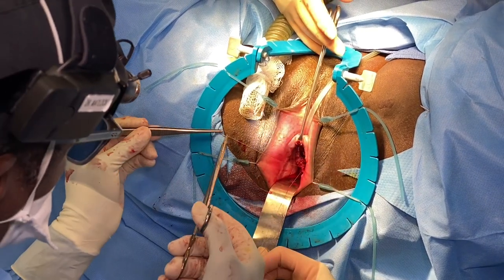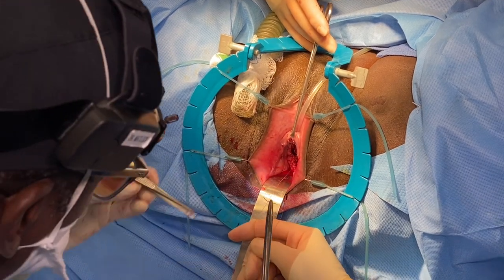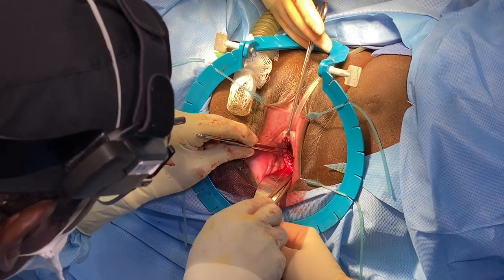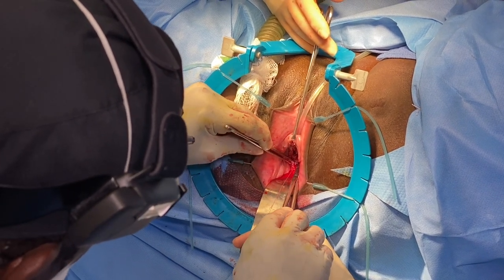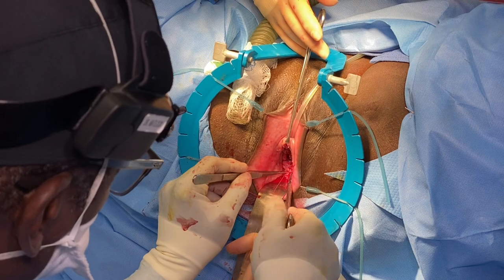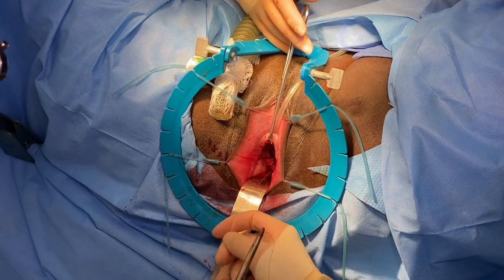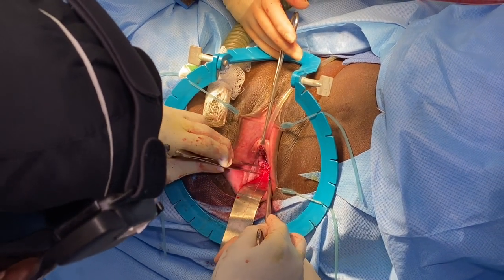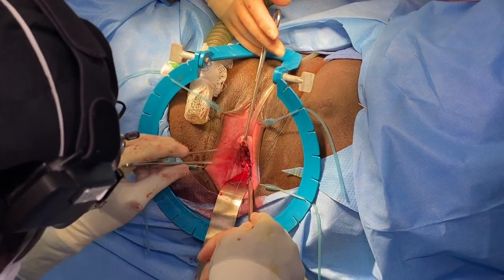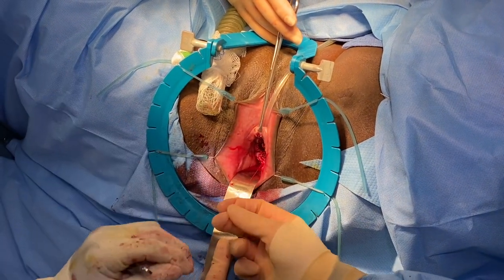It's a completely outpatient procedure. She had what we call a pudendal block. She won't feel anything for 18 to 24 hours. A pudendal block is a nerve block. It's just like when you go to the dentist, that's a nerve block, but that only lasts about 2 hours. This will last 18 to 24 hours. Afterwards, she'll have a strong pain medication, Percocet, and she will have antibiotics for 1 week.